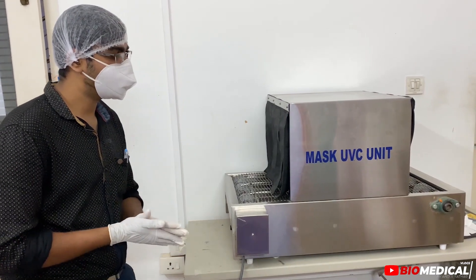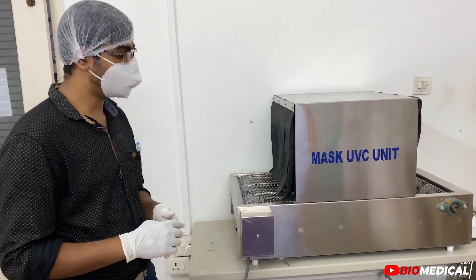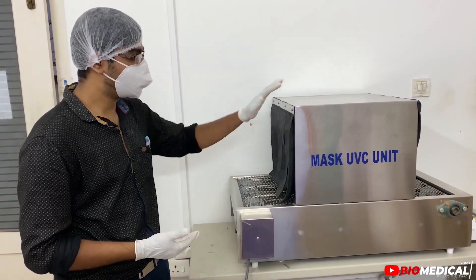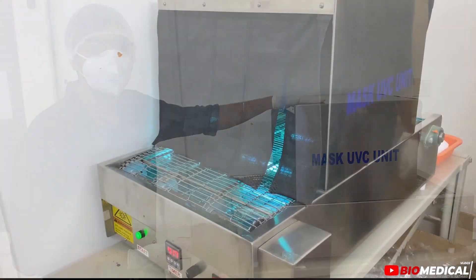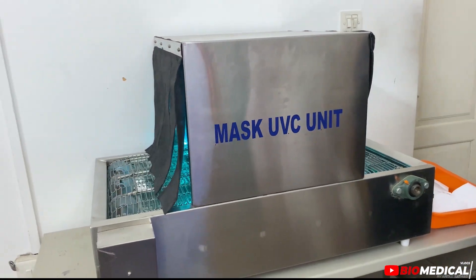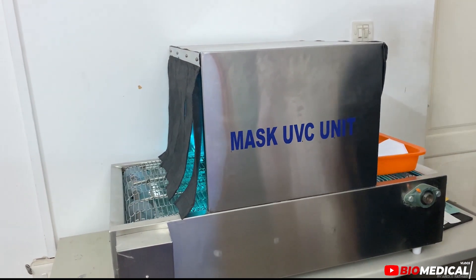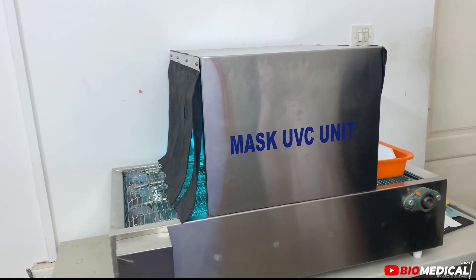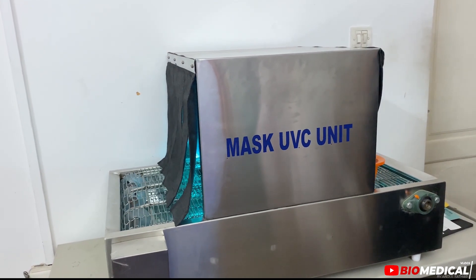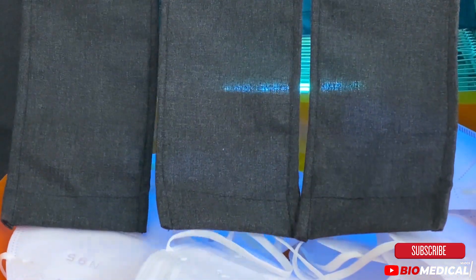This is a UV machine. It is a UV machine. All of the masks are finished products. We are using a UV machine for the final stage.